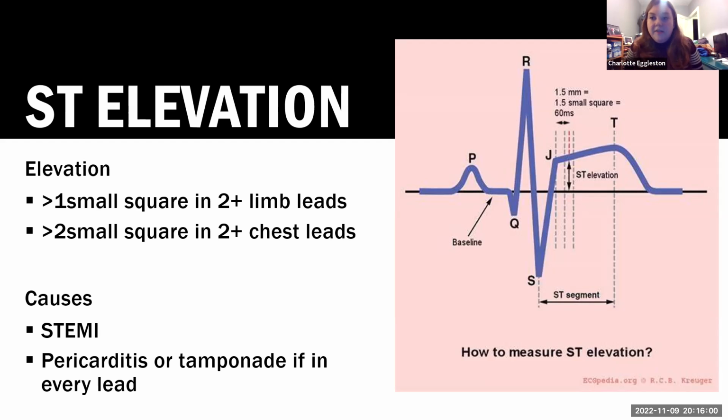So in a younger person with a recent virus, it's more likely pericarditis. Tamponade, you're going to get other signs. So you're going to have muffled heart sounds. You're going to get a raised JVP. You might have signs of acute heart failure because the heart can't expand. So they're going to be clinically quite different. But if you're worried, I'd get a bedside echo, would be my main test. But probably from the ECG, there's not going to be that much more that you can tell.